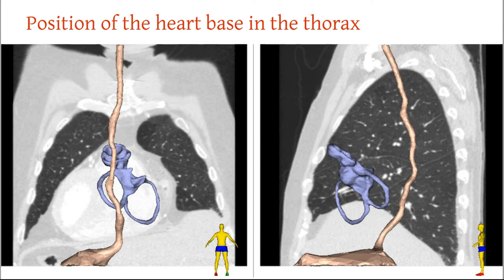Because if you do exactly zero, you're either going to get the coronary sinus back here. And if you move it up to get the middle of the mitral valve, you're going to have too much aortic valve in your view. And then the upper esophageal window would be up here. The airways are passing in between.